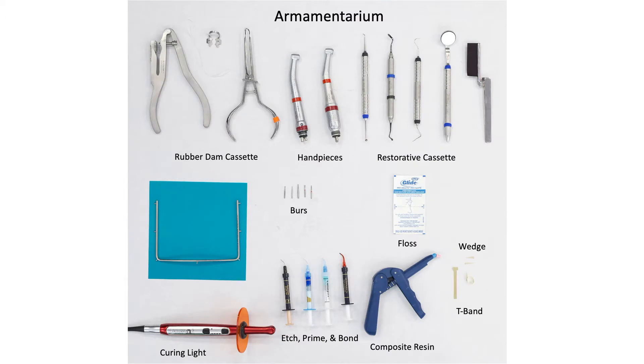The armamentarium for this procedure includes rubber dam cassette, handpieces, restorative cassette, burrs, floss, wedge, T-band, composite resin, etch, prime, and bond, and a curing light.